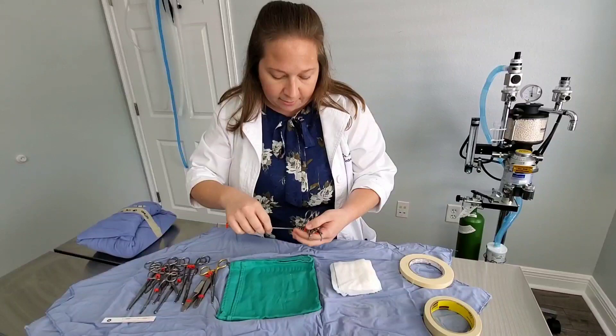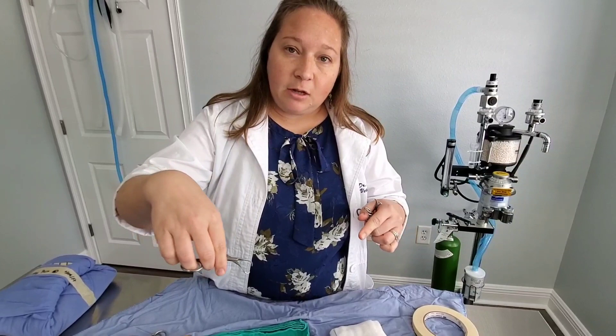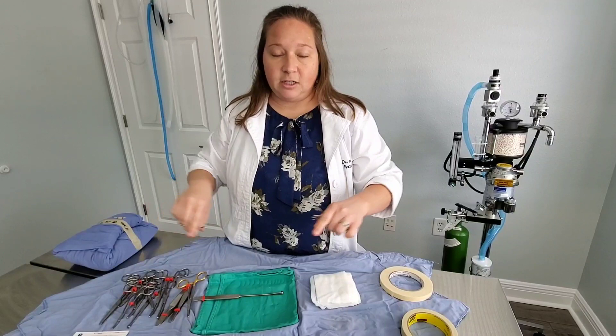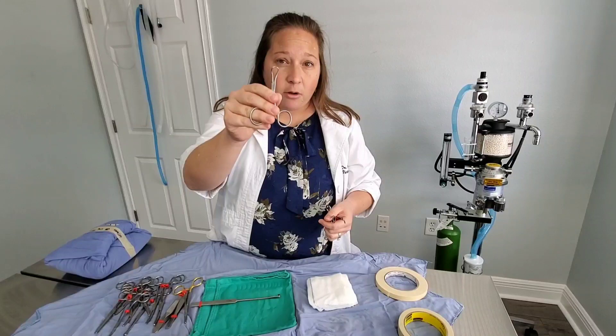These little guys are called towel clamps. Towel clamps are pretty cool — we use them for lots of different things. They have a really sharp point on them, and they help me when I'm draping in with my towels, lap sponges, and drapes. We do what we call four corners, placing them on each corner of my incision area to keep everything sterile. I also use them to pin tissue out of the way.